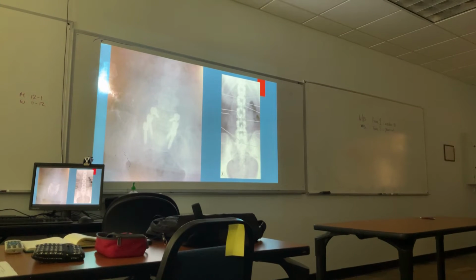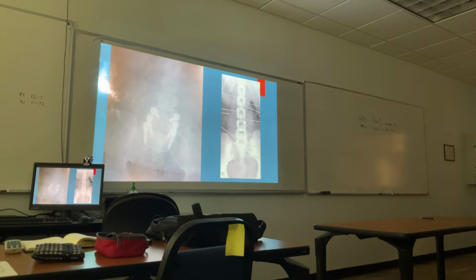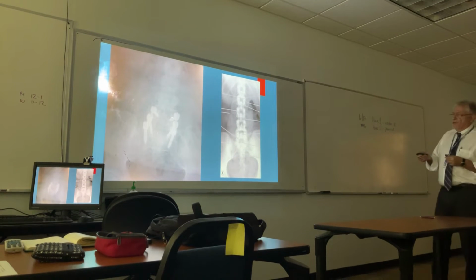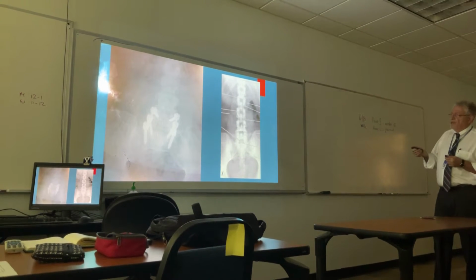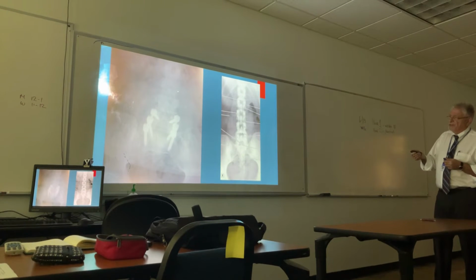Observation, normal, not normal. Surgery. What kind of surgery, or describe the surgery? Fusion, okay. So the strongest point is the pedicle. The observation I wanted you to make is, these are what? Spinous processes. What's missing here?